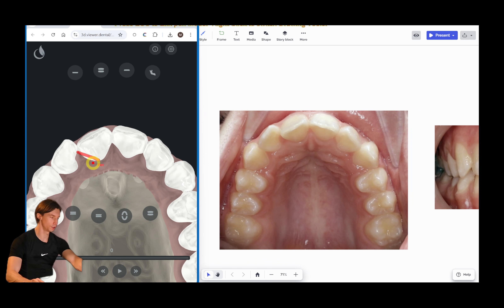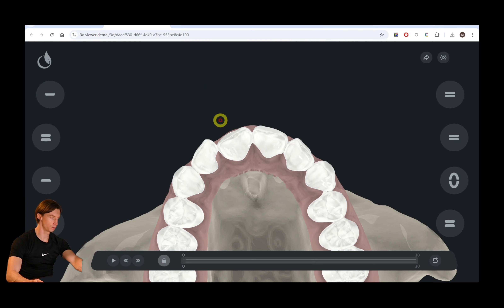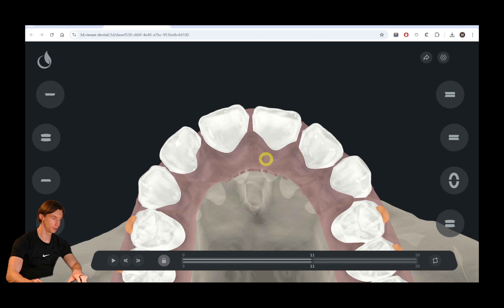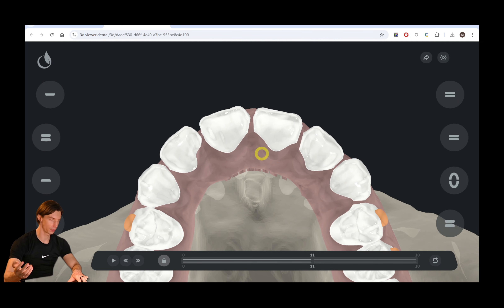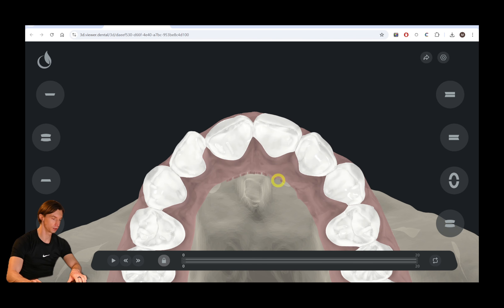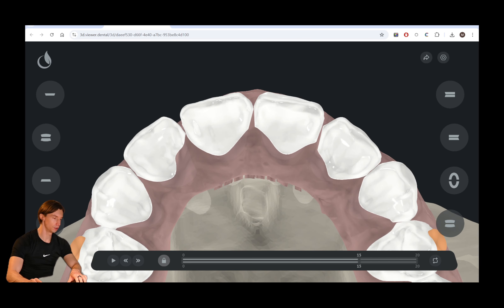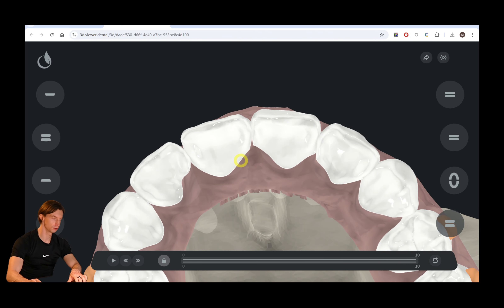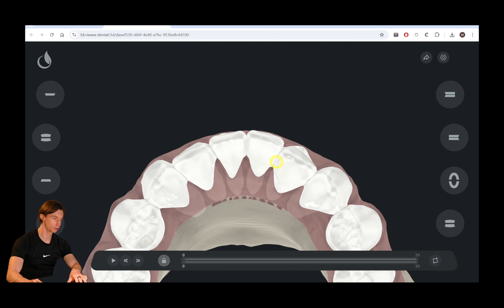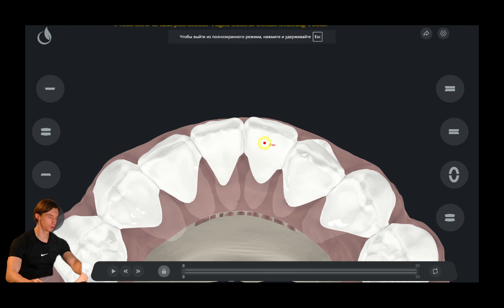First of all, we cannot move the teeth right from the start because there is no space. So we have to create some space first — we move the teeth with vestibular tipping, create some gaps and spacings, and at layer 2 we retract the teeth and finally align them. The IPR is done at very final stages.